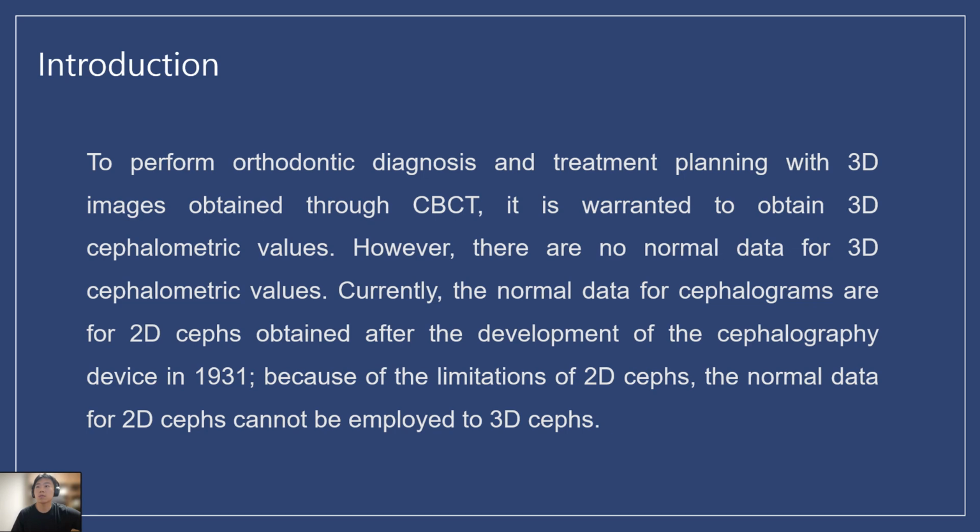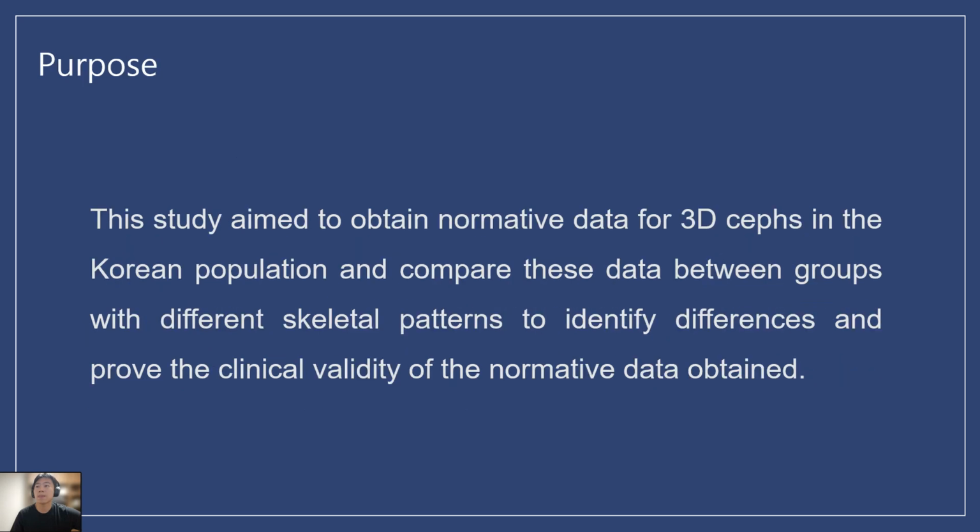Because of the limitations of 2D images, the normal data for 2D images cannot be employed for 3D images. This study aimed to obtain normative data for 3D images in the Korean population and compare this data between groups with different skeletal patterns to identify differences and prove the clinical validity of the normative data obtained.